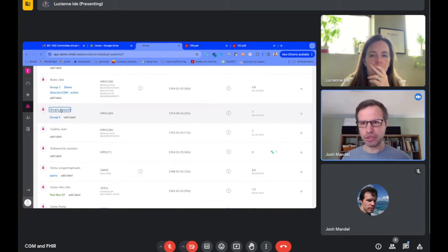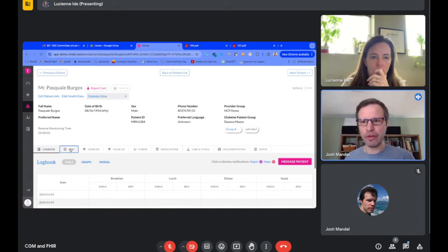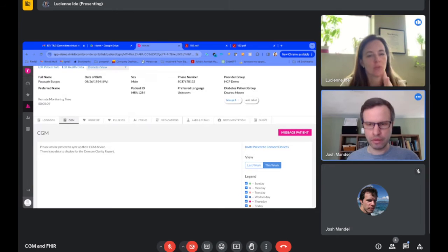They would write the patient a prescription, and the patient's just going to go and fill that prescription like normal. They're not going to get a device sent to them that's pre-bound to a certain account in this scenario. Is that right? Correct. I mean, there are two scenarios.